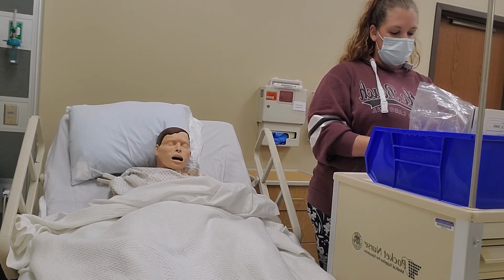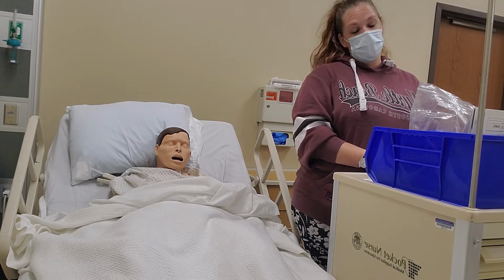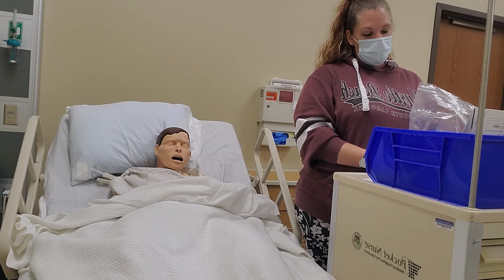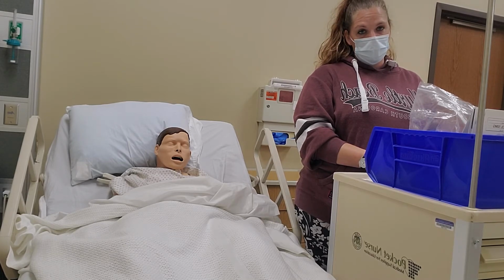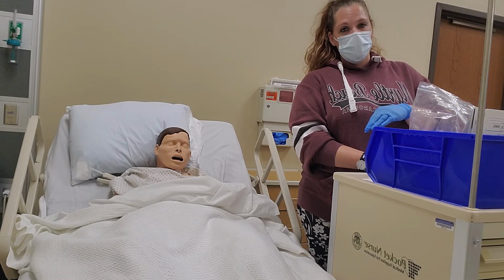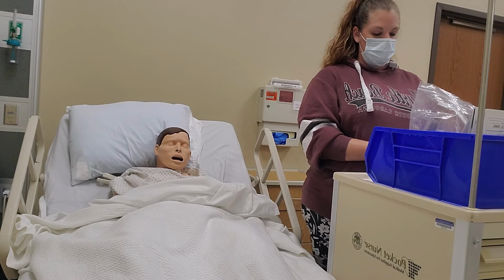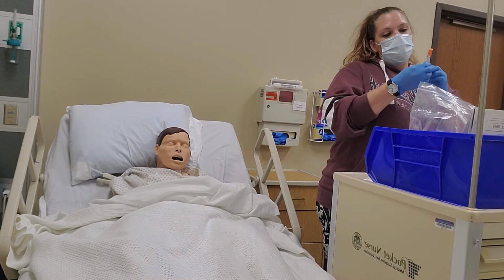Being that we're going to draw up 5 units of each, I'm going to need 10 units of air. I will inject 5 units of air into the NPH one, and then 5 units into the regular, and then start drawing up from the regular. So 10 units.